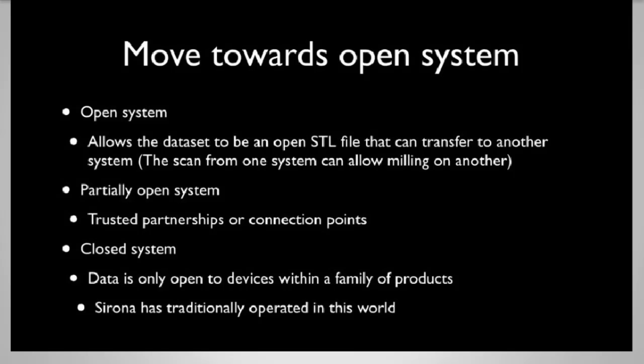The polar opposite standpoint has what we call a closed system. A closed system says a given scanner can only output to a given mill. It can only merge with a given cone beam CT, etc. It's a very closed environment. Traditionally, the CEREC or Sirona environment has operated in this closed environment. The benefit to that is there's one person or one company that's responsible for the entire workflow. The downside to that is you don't have choice.